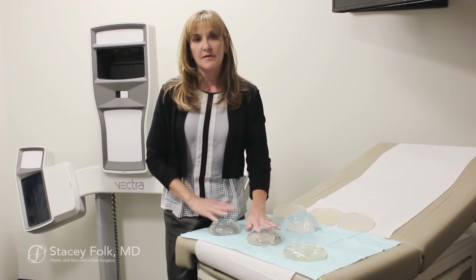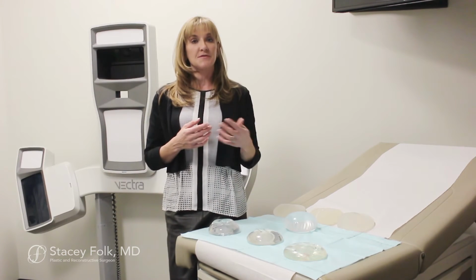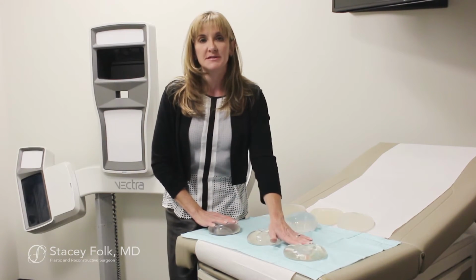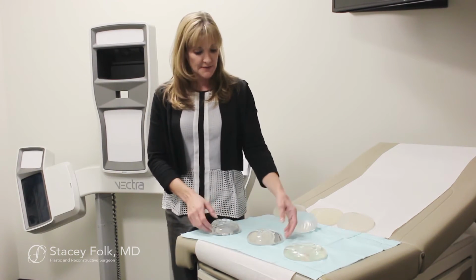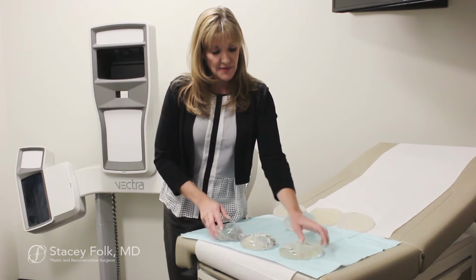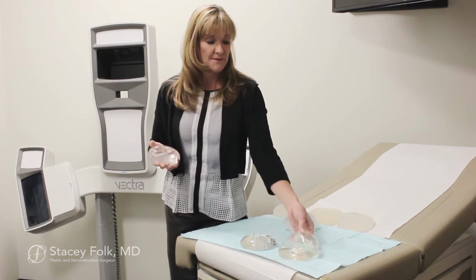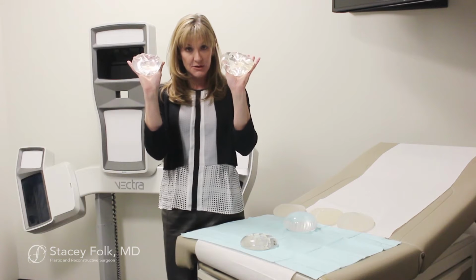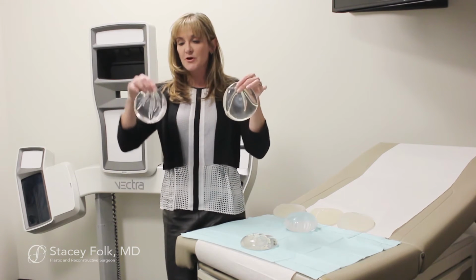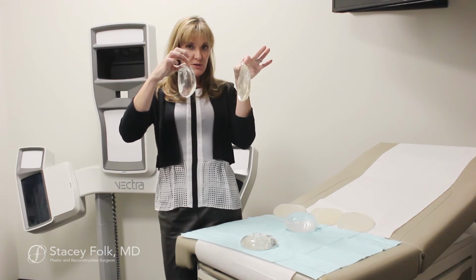Now, another thing that you're faced with is the selection of profiles, and having that option of different profiles is great because not everybody is after the same thing, and every body type is very different. Now, these 3 implants are all from the same company, and they are all the exact same volumes. This is a 325cc implant, and this is a 325cc implant. So you can see these are very different when they come to the diameter and also to the projection.